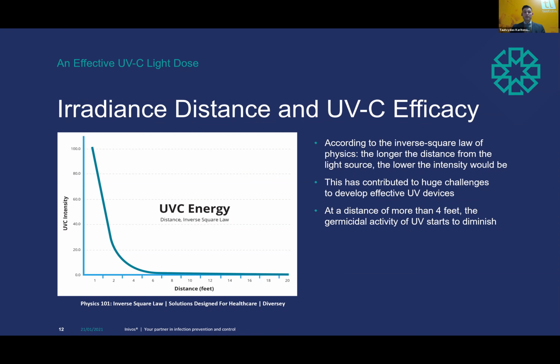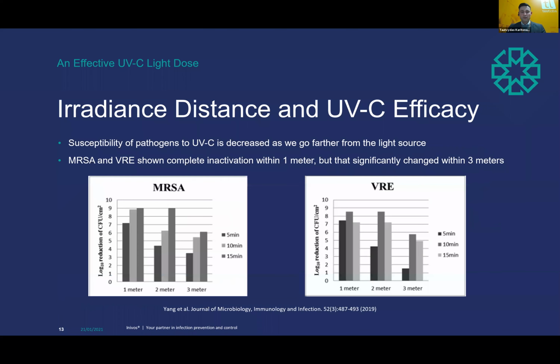You may well achieve the same Z value, but it should be stated as 100 millijoules per square centimeter per 5 minutes at this temperature, at this relative humidity, as a fuller picture of how effective that is. You may find that the same dose at different rates could have a different effect. It's well documented that with the same light source, like in this study here, at different distances, giving the same amount of exposure in minutes, the further you get, the less efficacious the process is.